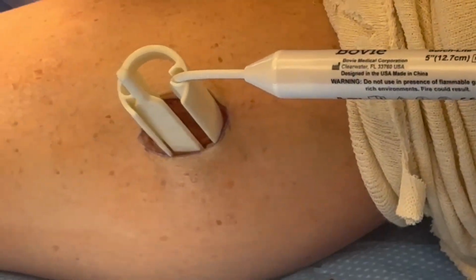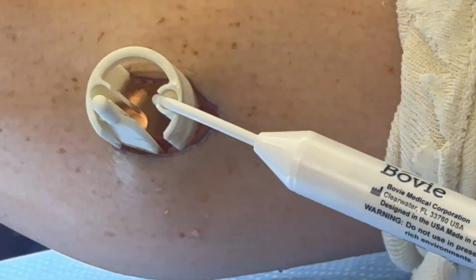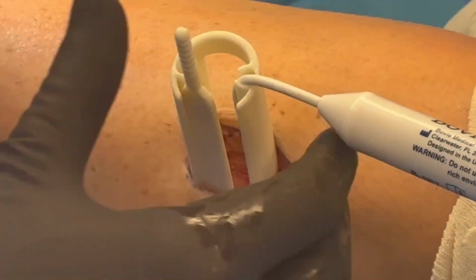And then we're going to slide in what I call the backstop between the gastrocnemius muscle belly and the fascial layer to act as a layer of protection to try to reduce the amount of injury to the muscle. The 2 main complications I see with this procedure are hematoma, calf hematoma, and then wound dehiscence. And this will hopefully significantly help reduce the calf hematoma.